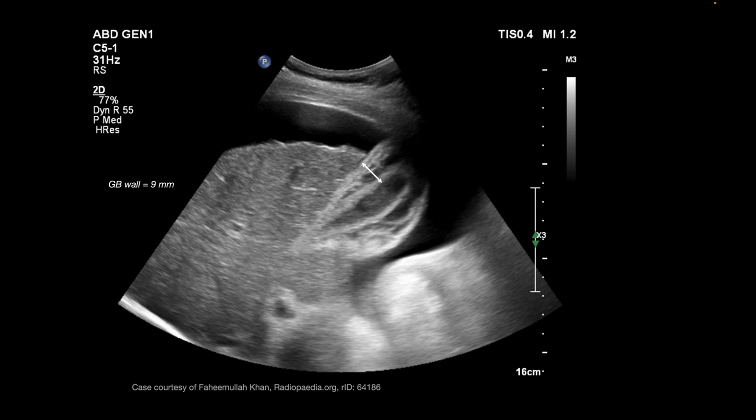And think of the gallbladder as the eyelids of the abdomen. So anything that puts the venous pressure up, swelling and edema, or causes inflammation locally, basically causes the gallbladder wall to thicken up. Now, it may be due to cholecystitis, but in this case, where you've got a patient that's clearly got probably portal hypertension with a cirrhotic-looking liver and ascites, that fluid in the gallbladder wall is probably purely the result of that process rather than an actual primary gallbladder problem. We also see that picture in patients with heart failure, and also patients just with things like bad pancreatitis can get this as well.